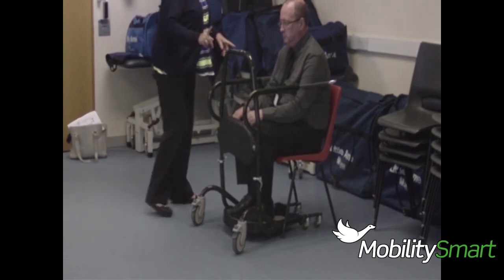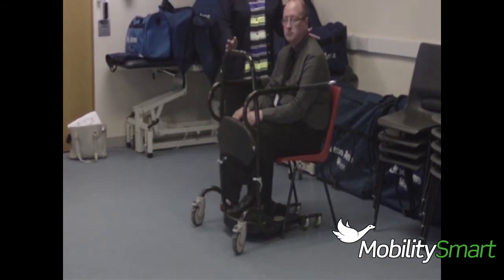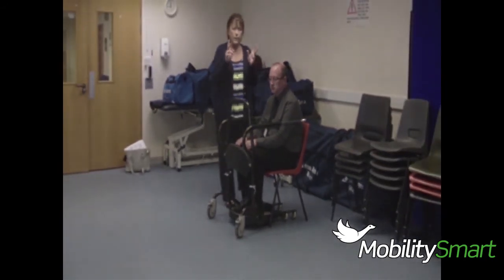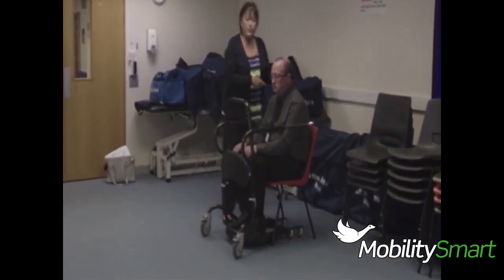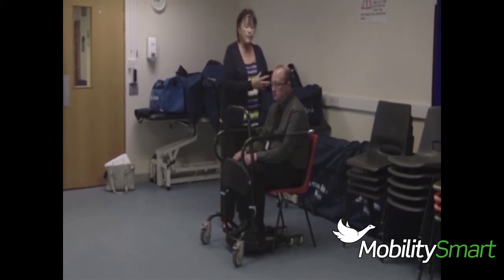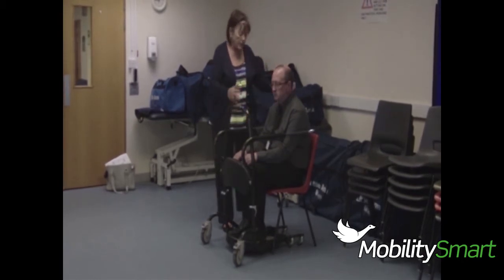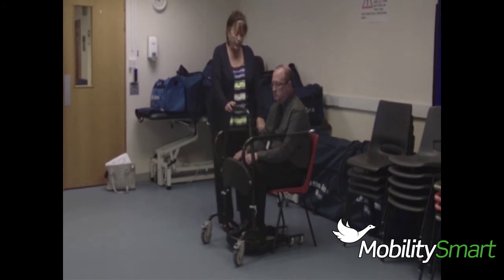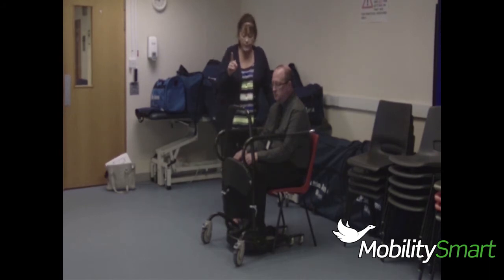What we've done here is that we've reduced the amount of space that the client has got to work in. Now, let's bear in mind here, if they were in a wheelchair or a glide about, something with brakes, that would also have the brakes on as well. So this section is all very small, very secure, and nothing can move. With this in mind, we've only got this small space, so the client has only got a small space to fall into. And the only place that they can fall during the transfer is back down into this chair.